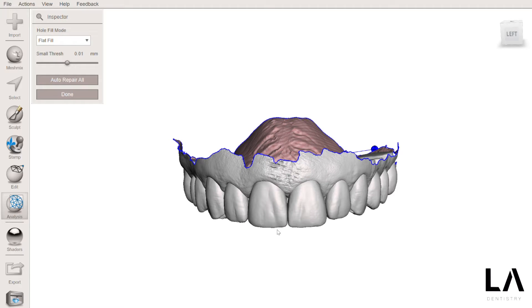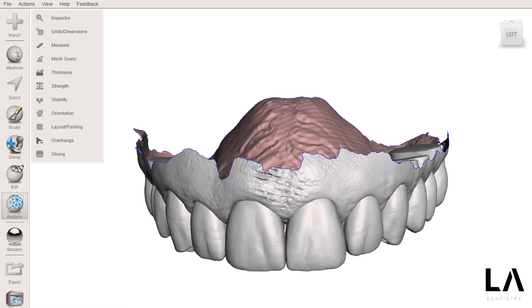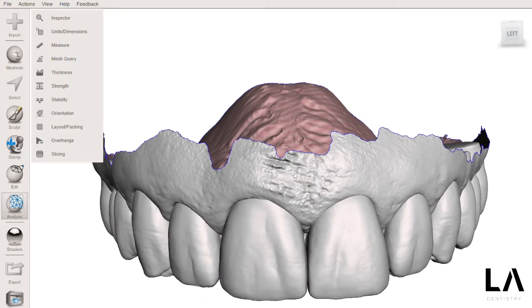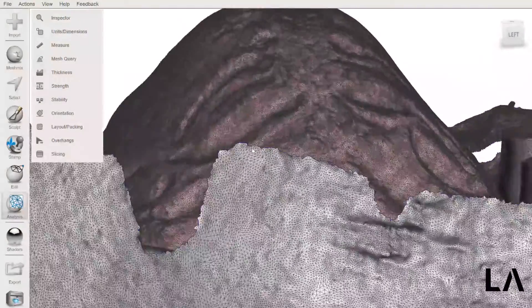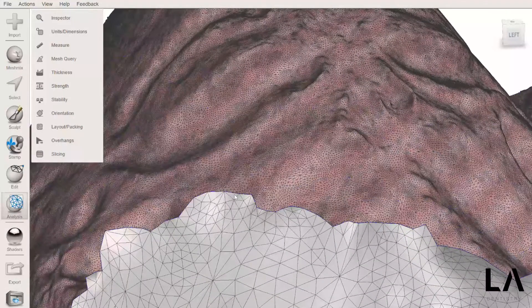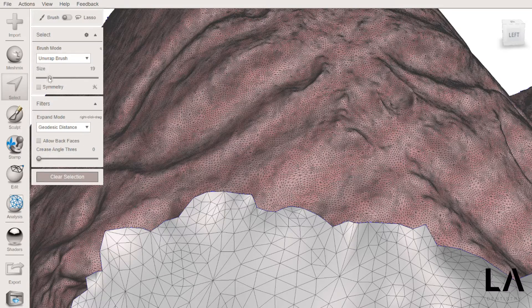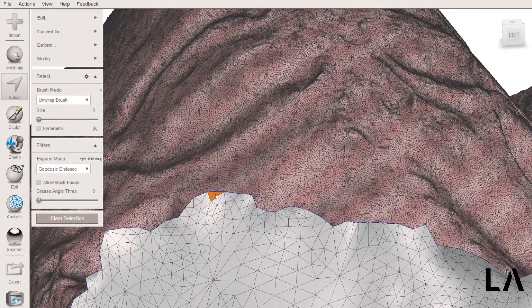Because I want to create a base for this model. So now I'm going to press the letter W to have access to all the triangles that are in the mesh, and I'm going to select with the smallest size brush and double-click the border.